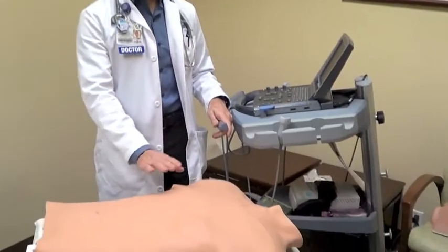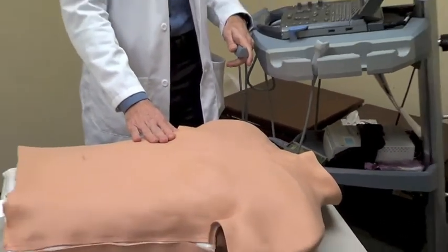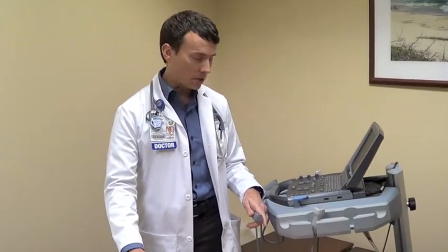The first thing you want to do — this is going to be a thoracentesis, an evaluation of a pleural effusion in a critical care scenario. For that reason, I'm actually going to leave the mannequin in a supine position. Alternatively, if this is done by the bedside with an ambulatory patient, one can do the same procedure taking a posterior thorax approach with the patient sitting up. In this case, the patient is supine.